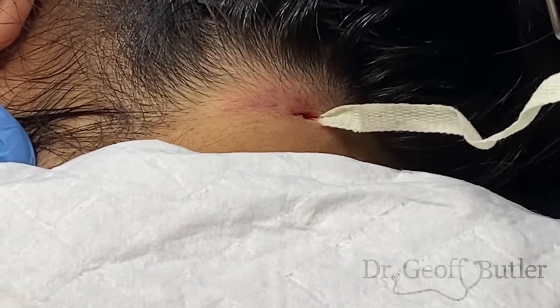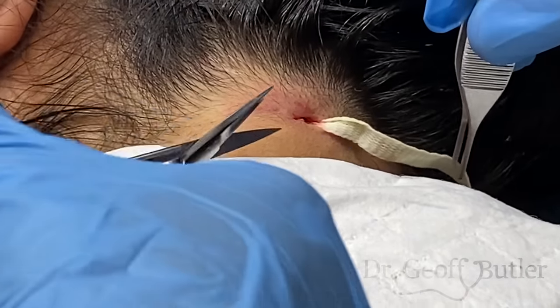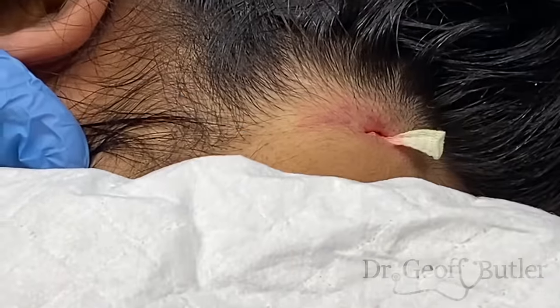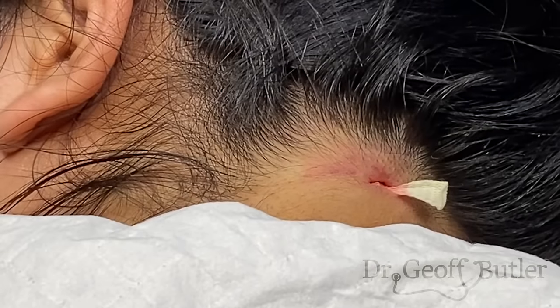Right, do you want to clip it right here first? And then clip it down by the site. Okay. Yep, perfect. Good. All right, so she's going to clean you up a little bit, then we'll book you back in to see you tomorrow.